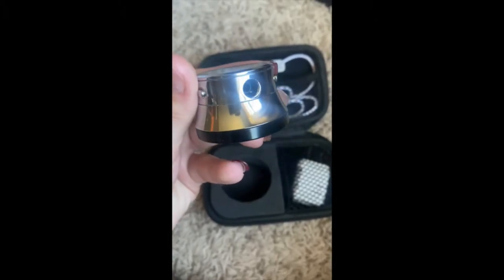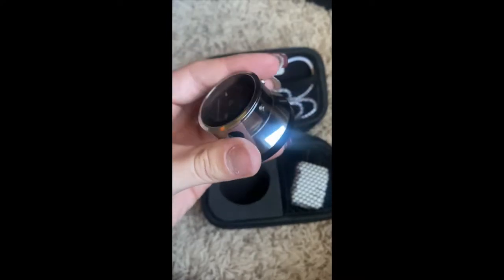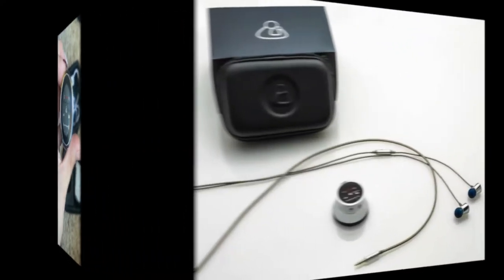The stethoscope has controls that can adjust the volume as well as the filter, which refers to the level of low, medium, or high frequency pitches.